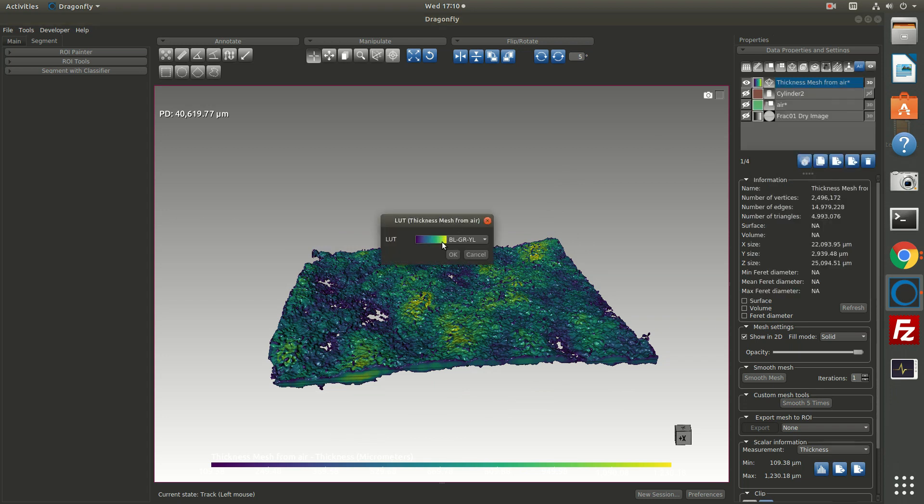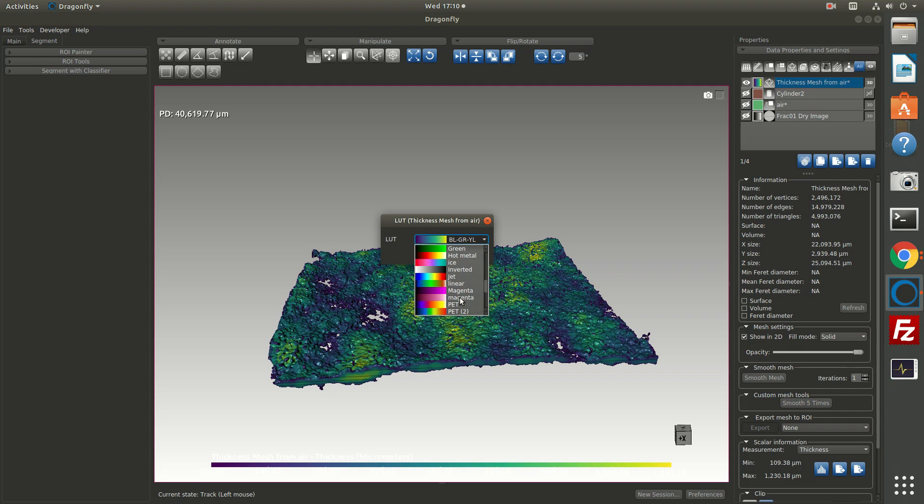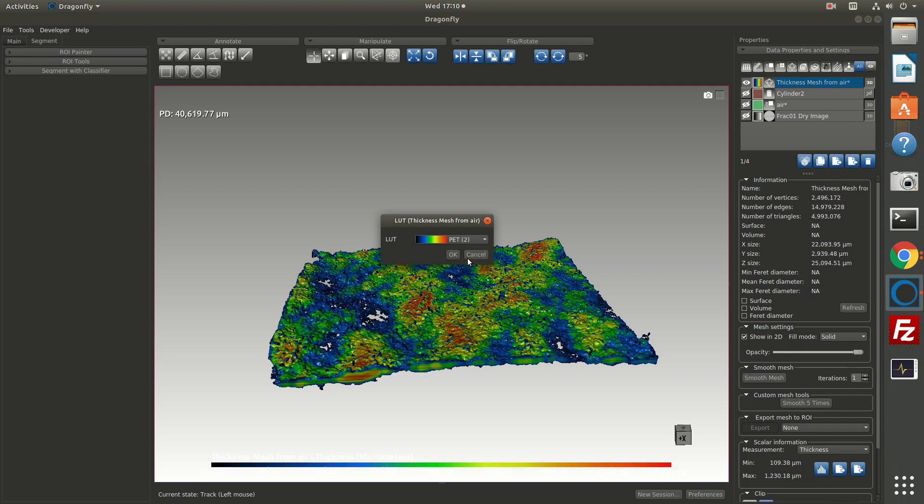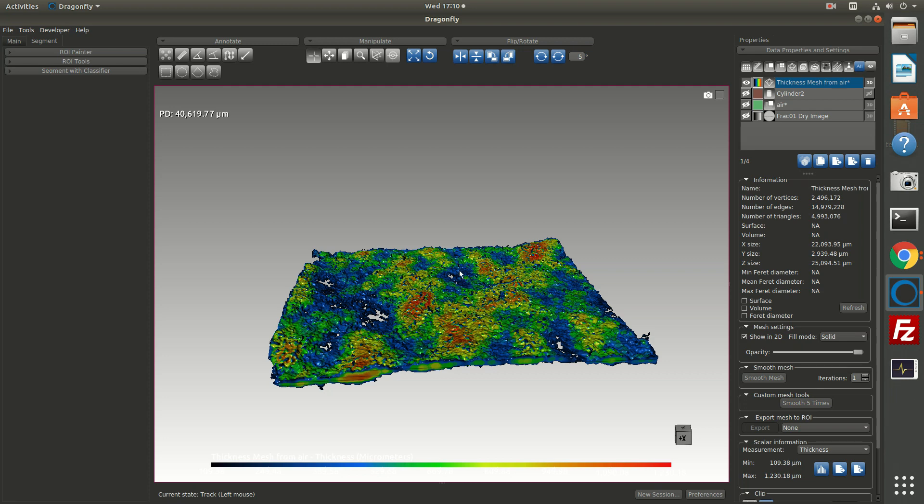Right now it's colored with this lookup table, but if I right click—sorry, if I single click with the left mouse, I can choose another lookup table. So I could choose, you know, a rainbow sort of lookup table if I'm interested. So now the thickest areas are in red.